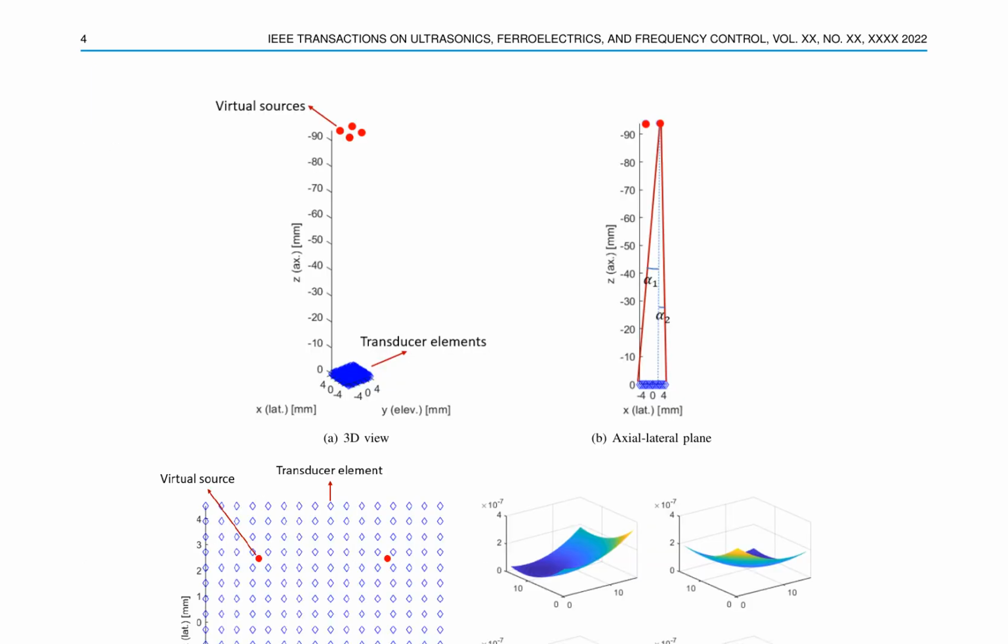The novel method for 3D curl calculation in ultrasound elasticity imaging involves a combination of diverging waves and the GLUE 3D algorithm to estimate tissue displacement. This technique generates virtual sources behind the transducer, adjusts parameters for smoother displacement maps, and fits displacement phasors using a least squares solution. The curl calculation process projects axial, lateral, and elevational displacement phasor volumes onto a fine 3D grid with a step size of 0.05 mm, equivalent to the axial resolution of the beamforming grid.